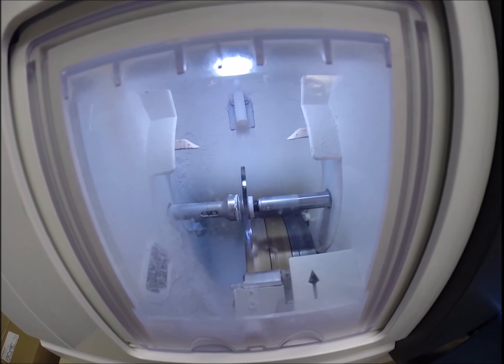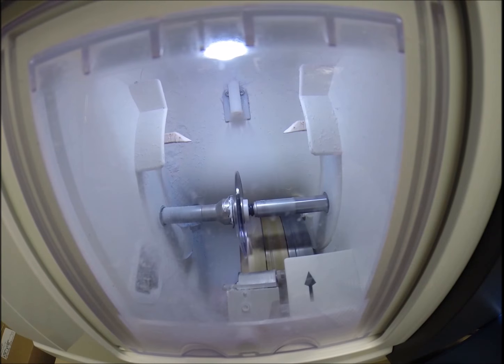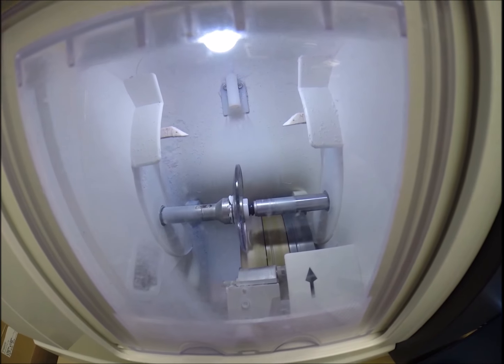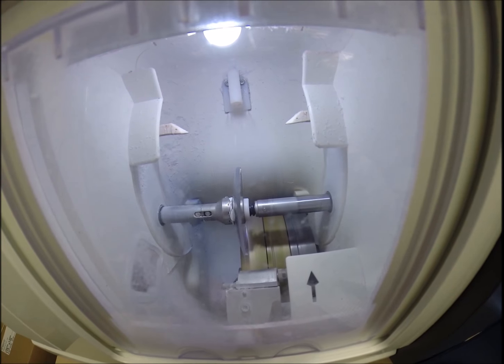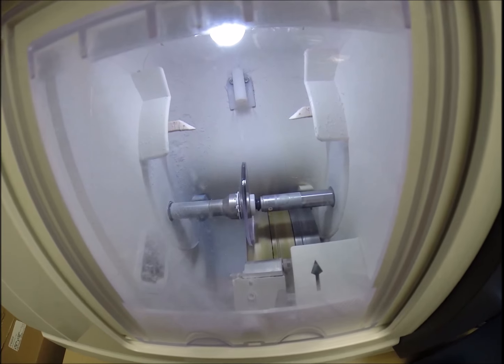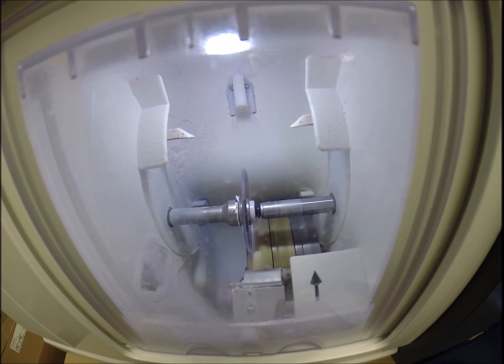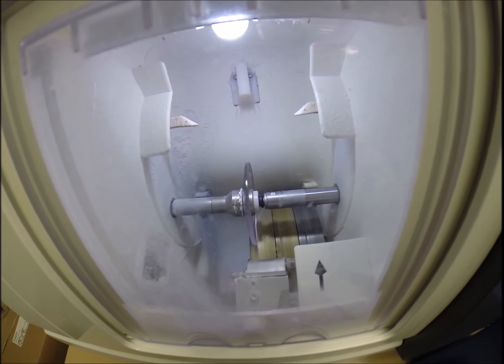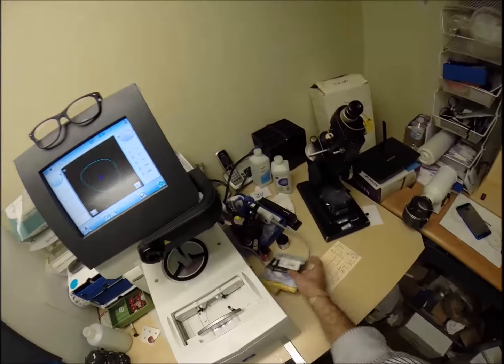So if you see light flickering in the background, that is water there to catch the optical sawdust as it comes off the cutting wheel. Polycarbonate lenses cut dry where plastic, high index plastic, and Trivex cut wet. Now water will spray onto the lens for the last 20 seconds of the cutting cycle just to wash away any optical debris that you see beginning to form on the edge of the lenses. Now your lenses are made out of polycarbonate.